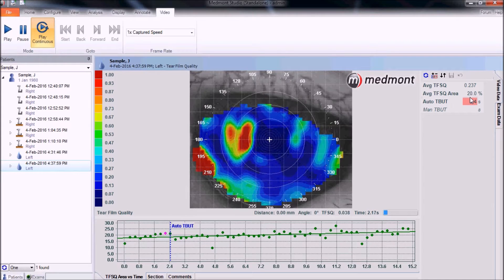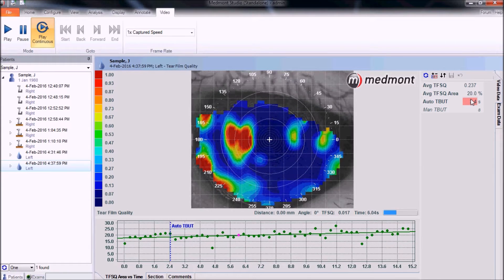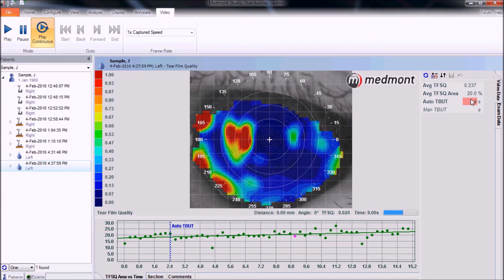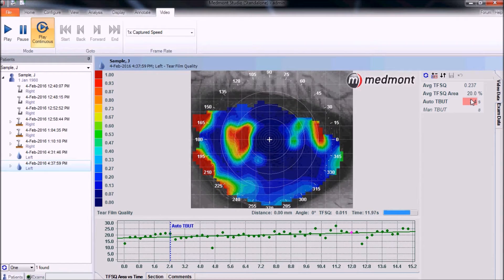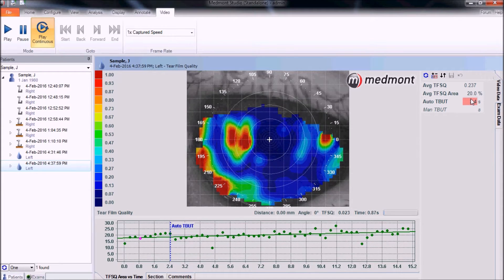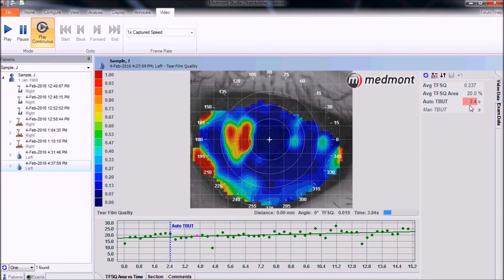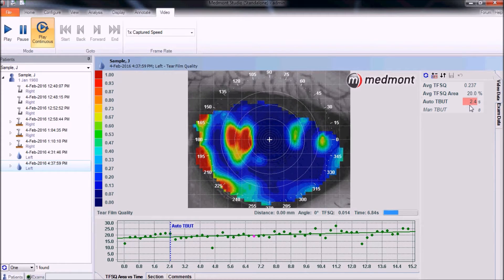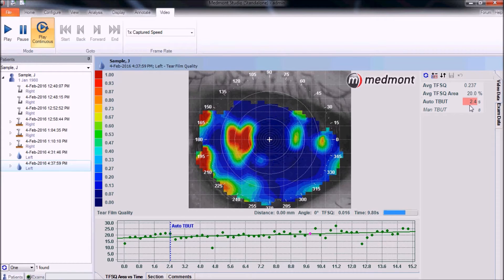The second value tells us the average area in breakup across all imaged captures — in this case, 20% of the surface area is in breakup. The third value, auto tear breakup time, tells us this patient had tear film breakup within 2.4 seconds.